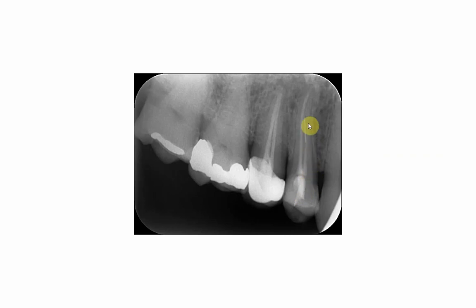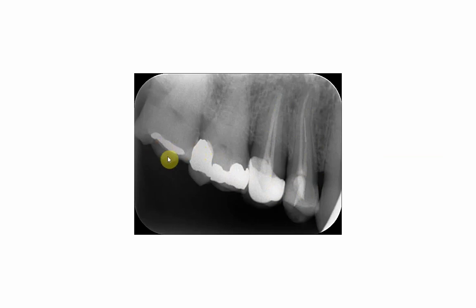To summarize: composite, gutta-percha, metal post, broken file or reamer, PFM, gutta-percha, amalgam, zinc phosphate cement, and composite — these are all the restorative materials identified in this radiograph.